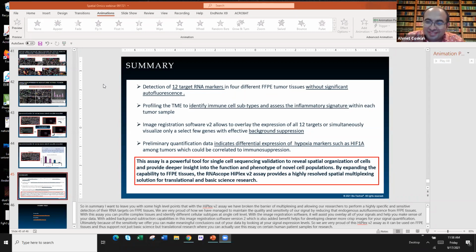No, and that's a great point. And to your point, we do have a few papers where researchers on their end have done comparative analysis between different assays. For example, we have a couple of papers where they have done quantification with RNAscope, and then they have done PCR for the same targets. And then they've shown the comparison of the number of transcripts in that way. We found some really nice papers showing comparable expression between assays. That's really also helped us build confidence that we are actually capturing what most of the other gold standard technologies are able to capture.